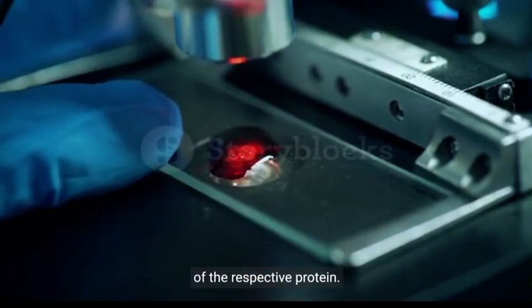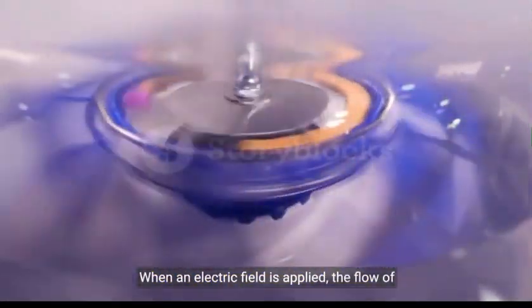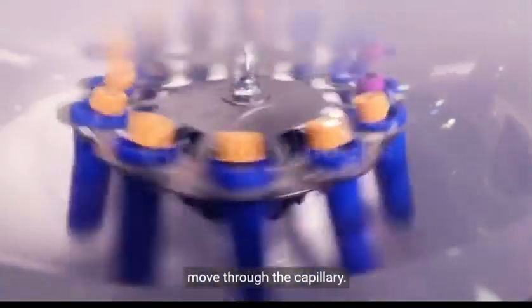of the respective protein. Capillary electrophoresis is based on electroosmotic flow. When an electric field is applied, the flow of liquid is in the direction of the cathode. Thus, EOF regulates the speed at which solutes move through the capillary.